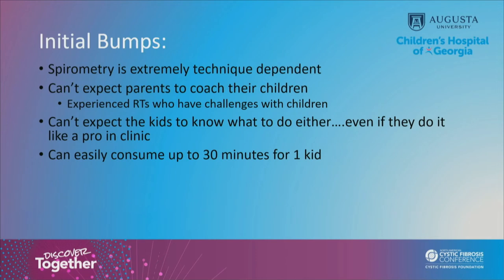And we quickly learned that we really can't expect these parents to coach the kids on how to do these spirometry efforts correctly. We have experienced RTs in the hospital whose sole job is this. They have training and experience in coaching children, and it's still a challenge for them many times. So it was really unrealistic for us to expect the parents to be able to successfully coach their kids. And we also learned very quickly that we can't expect the kids to know what to do either, even if they do it very well in the clinic.